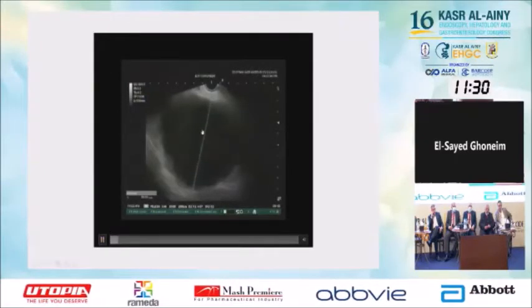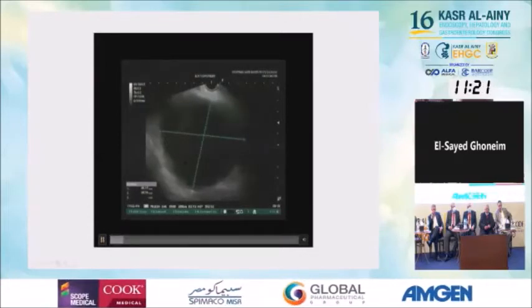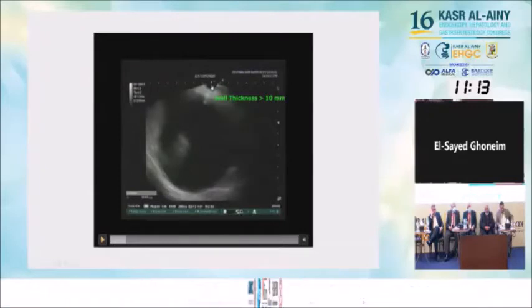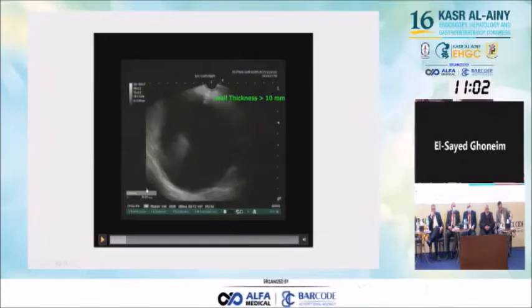The cyst is relatively large, about 9 by 11, unilocular, with a little amount of debris. But when we measure the distance between the gastric lumen and the cyst, it is quite large and thick, nearly 2 centimeters.